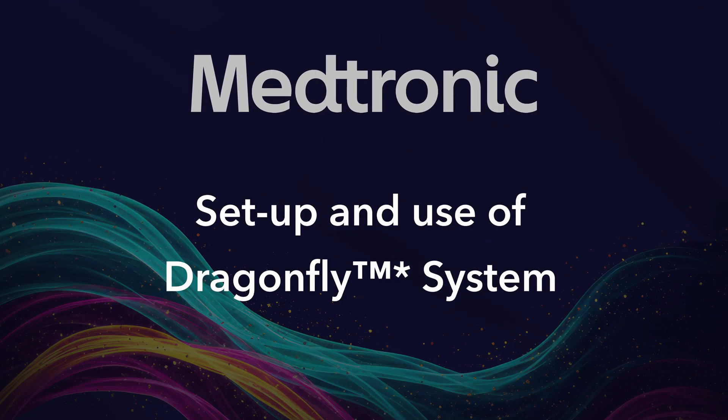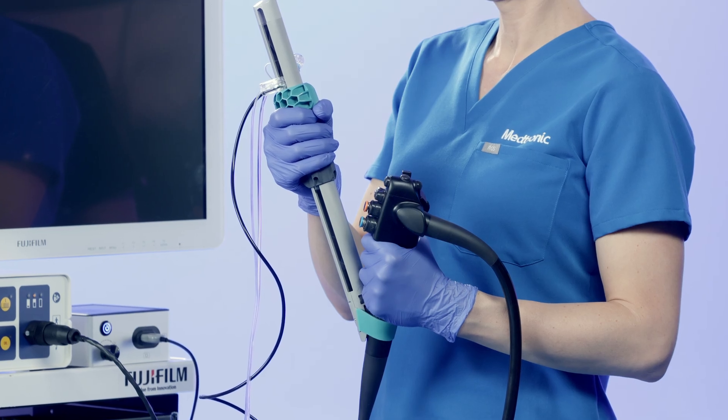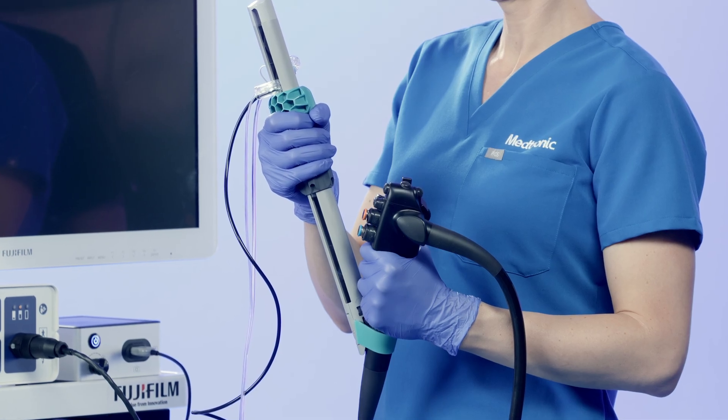Welcome to the Dragonfly System Setup Guide. In this video, we will cover essential information about the Dragonfly Pancreatic Biliary System, its setup, and procedural steps to ensure effective and safe usage during ERCP procedures.